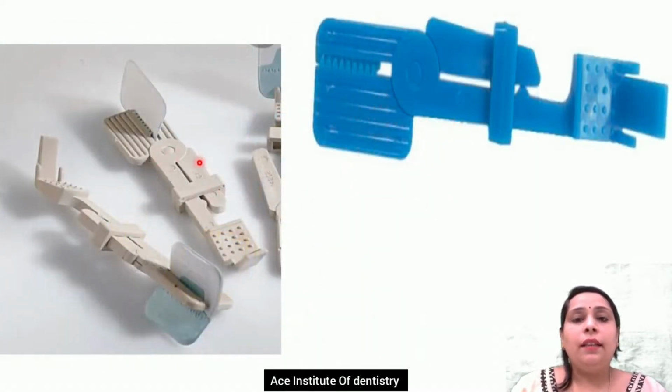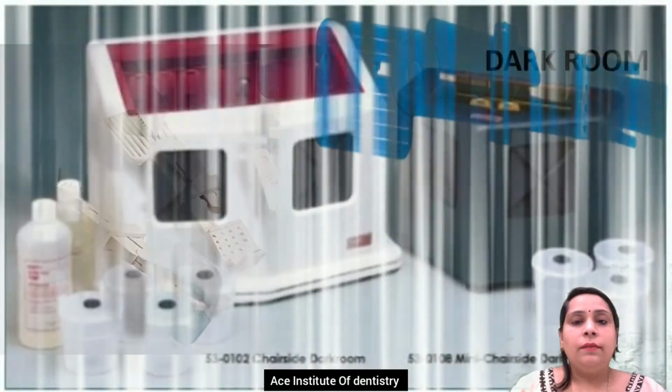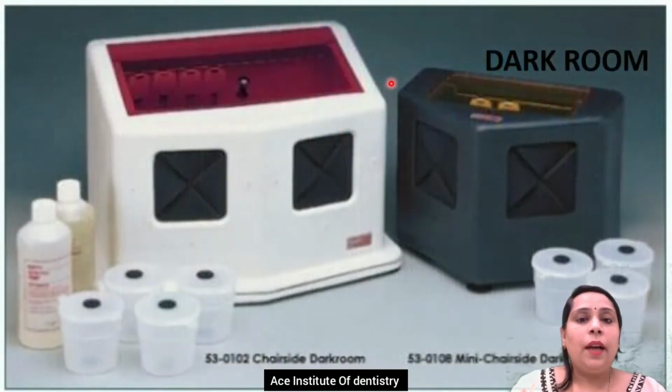Okay, these are the film holders where we have to hold here and place into the mouth. Now the darkroom. Having a darkroom in our clinic is space consuming, so that's the reason they have this developer box. We call it a chair-side darkroom. Okay, so how do we arrange this?